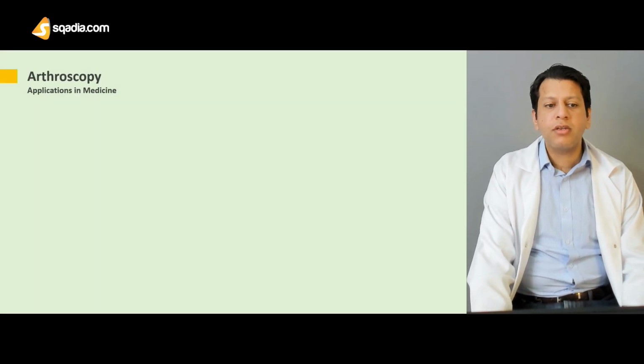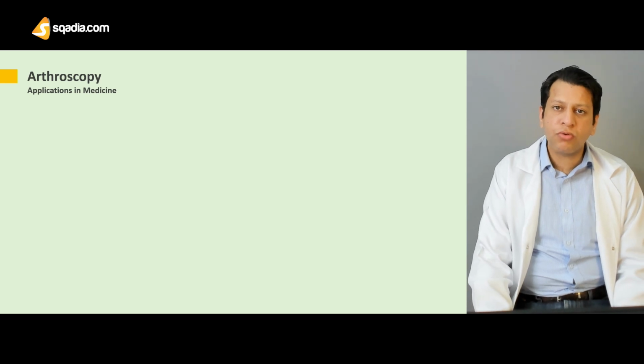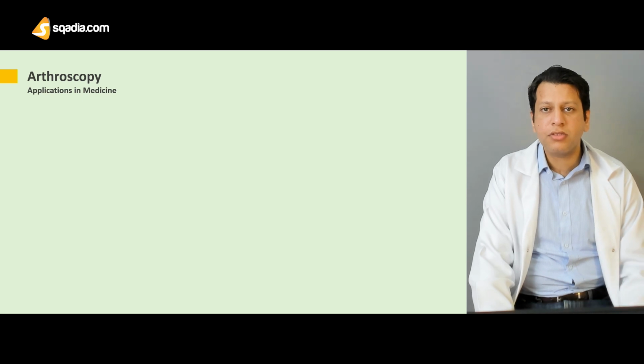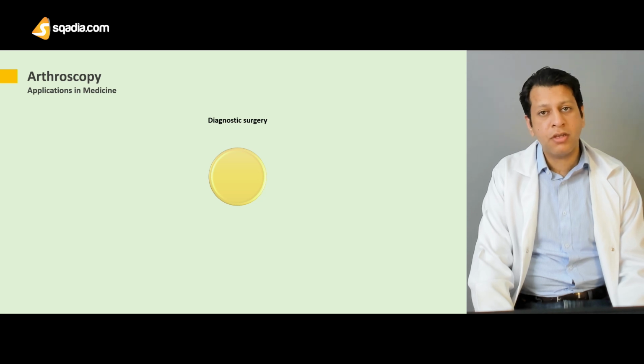So what is the application of arthroscopy in medicine? In medicine, arthroscopy can be used mainly, and most importantly, for diagnostic surgery.